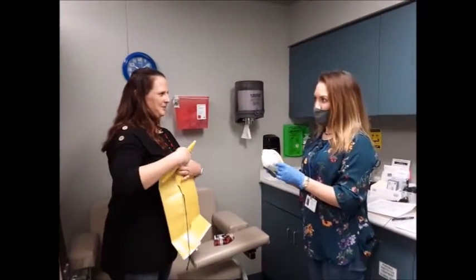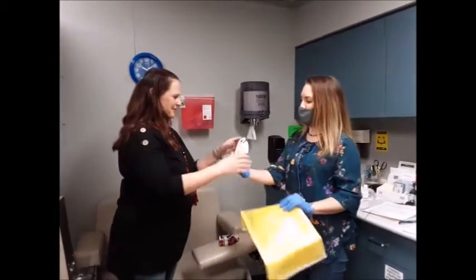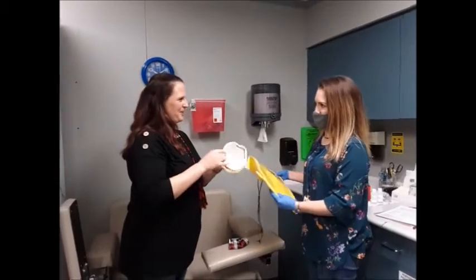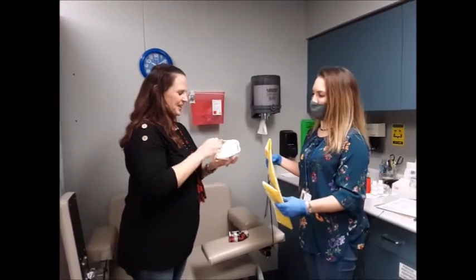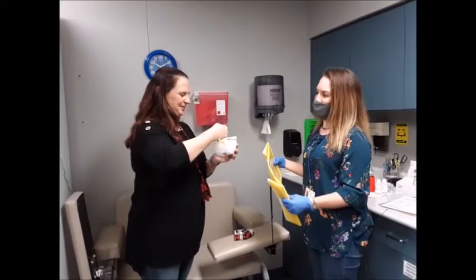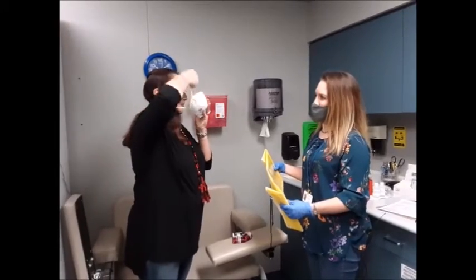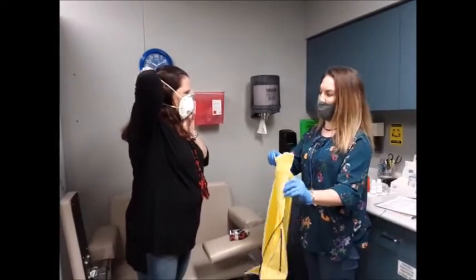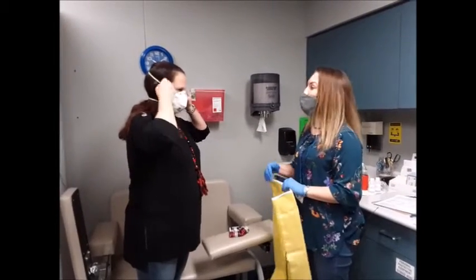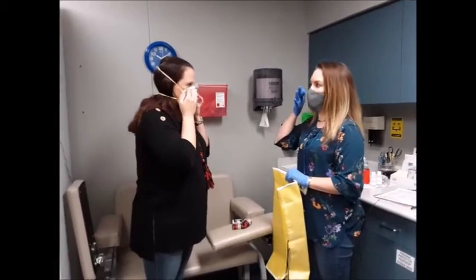Have you ever put on one of these masks before? Okay, so you know how to probably put it on. Go ahead and put this on for me, the way you were taught. I'm going to stretch it first. Go ahead and make sure you have a proper seal — squeeze your nose and press it underneath your eyes.